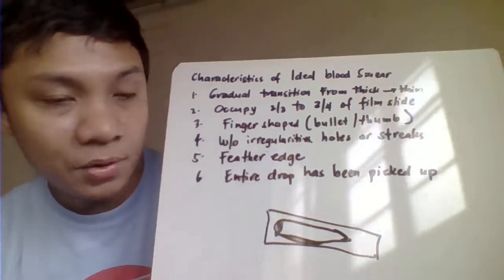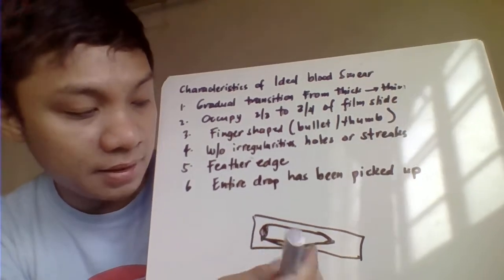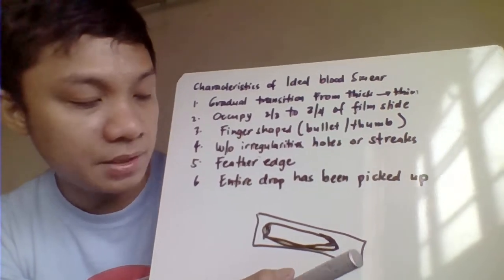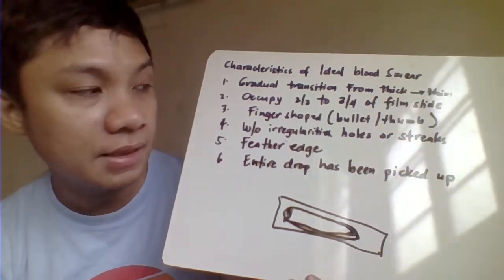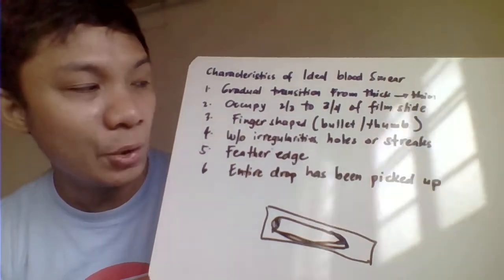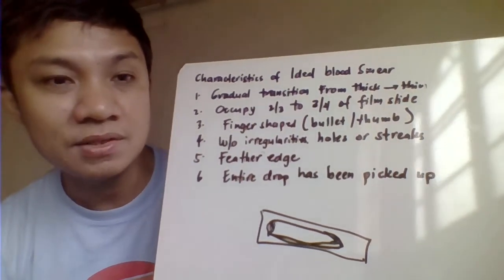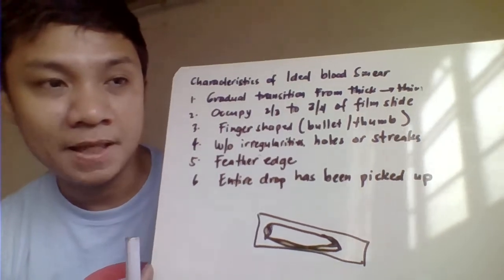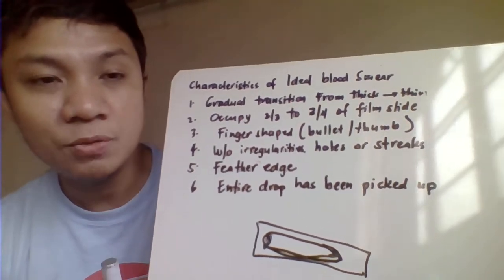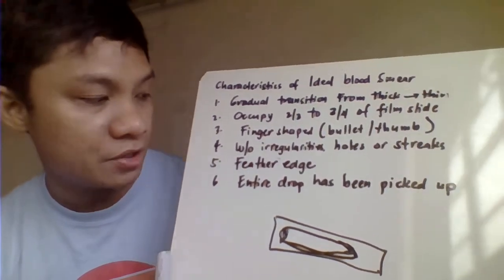na area. Another one, you should have here the finger shape, the thumb shape, or you should have the bullet shape. Ang end part niya dapat ganyan. So, thumb shape, finger shape, or bullet shape. So, you should have here without irregularities, without holes or streaks, without scratches. Okay, so most likely holes here because of your oil, diba? So, you should at least use your new slide, hindi yung mga na-wash na slide. Because most likely, pag na-wash na slide, may oil na yan, and that would eventually be responsible here for producing holes and streaks or irregularities in your blood film preparation.